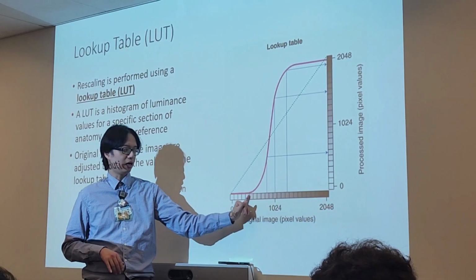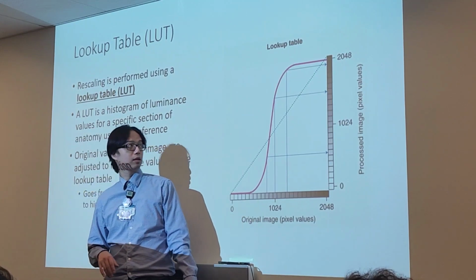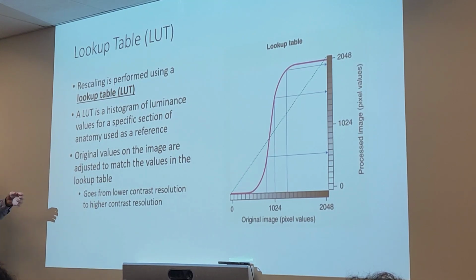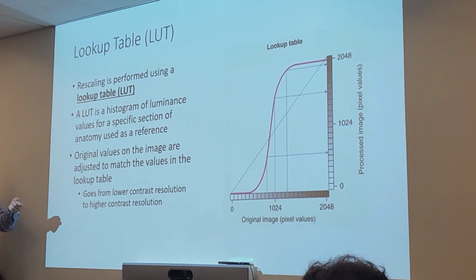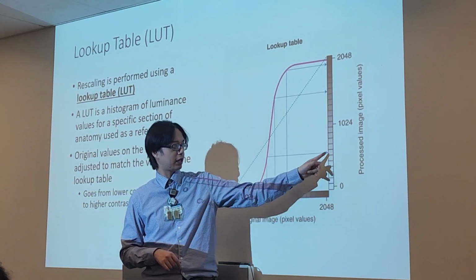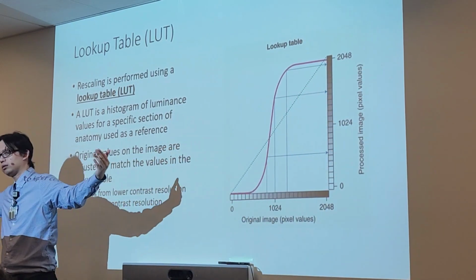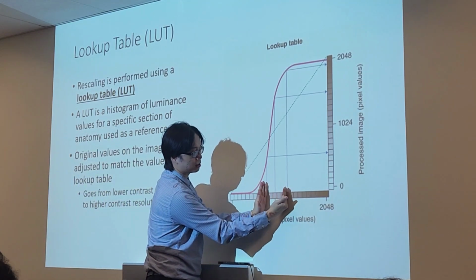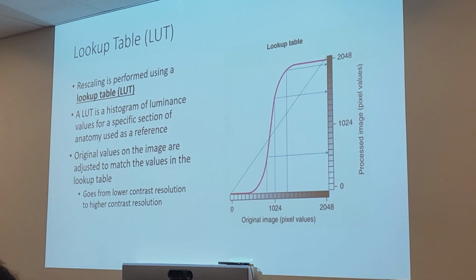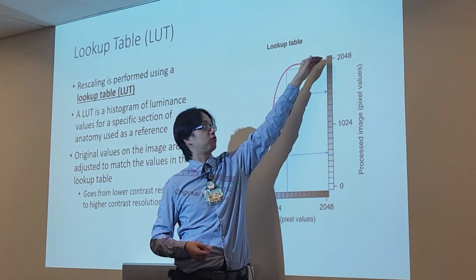Over here, we have our grayscale for the raw data, and we have a histogram here. The lookup table, right, is its own histogram. And so the lookup table says, well, if you've got a value in histogram A, we're going to convert that value into something else in histogram B. Right? So it's going to be like, all right, you've got this value here. I'm going to take this color and change it to this. Oh, you've got this color here. I'm going to take this color and change it to that. So it's going to expand the size of that grayscale, right? It's going to take something like this narrow and expand it here across a much bigger range of colors. So that way you have more blacks, you have more whites, you get more contrast, right? You're not just stuck in this narrow range of grays. Now you have black all the way down to white.